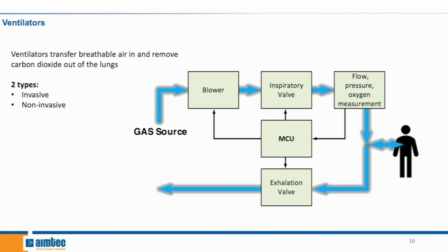We'll be having a look at ventilators. Ventilators are designed to aid patients who cannot breathe effectively or are unable to breathe by themselves. This life-saving equipment consists of a pump or blower that can transfer breathable air in and remove carbon dioxide out of the lungs.